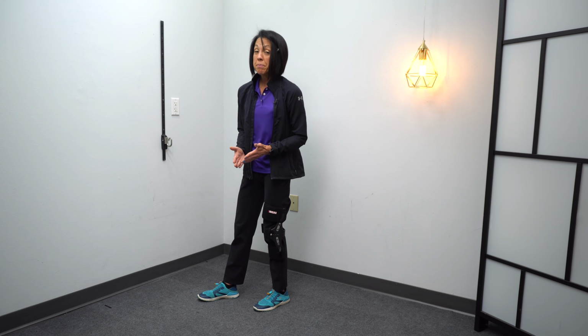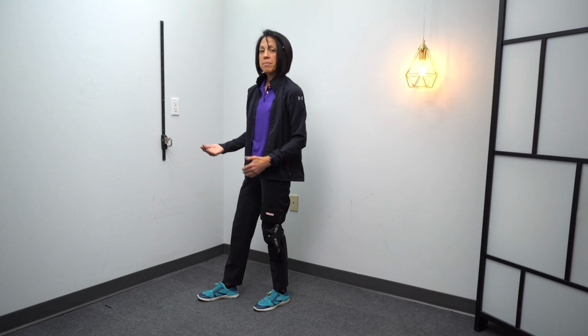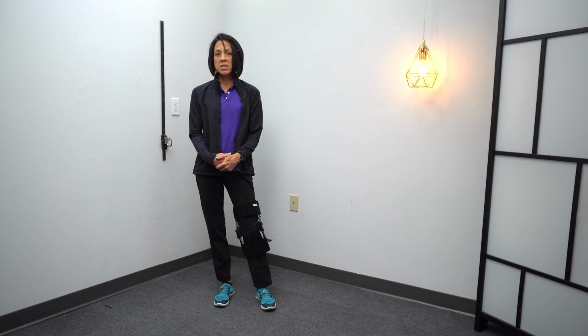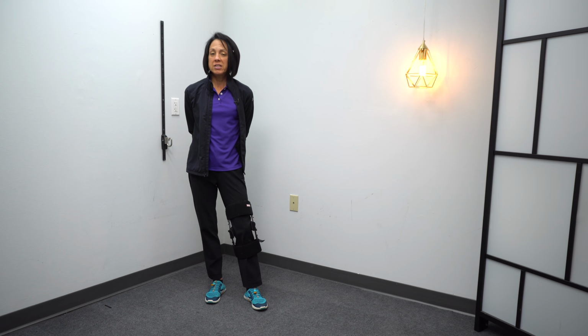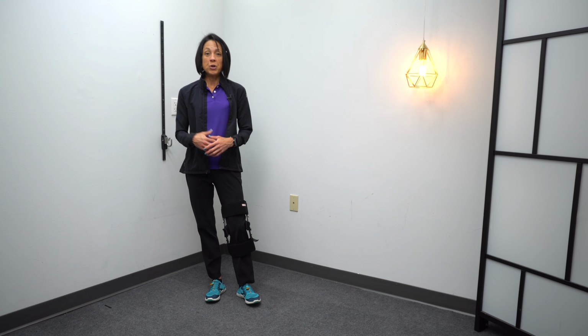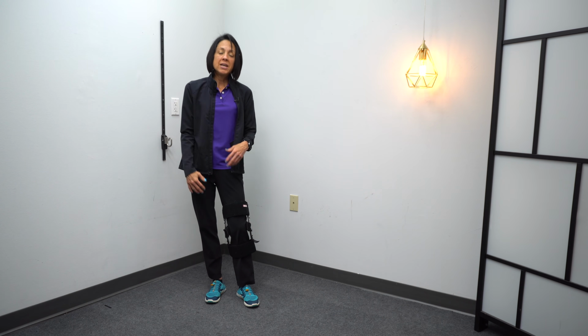So it really minimizes the amount of thinking that has to go into walking and will get you more to that automatic stage. Speaking of automaticity, the other reason I usually recommend a Swedish knee cage is if someone can do fine, they can do the crouch walking that I talk about a lot, they can keep their knee unlocked in their home and walk and everything's great, but every time they go out in public, they go right back into that knee hyperextension. That's going to happen for some of you because you're trying to get somewhere. To have to really think about keeping your knee unlocked when you're trying to get from point A to point B, it's just too much.